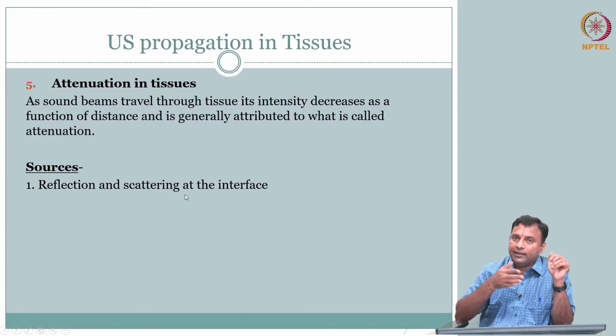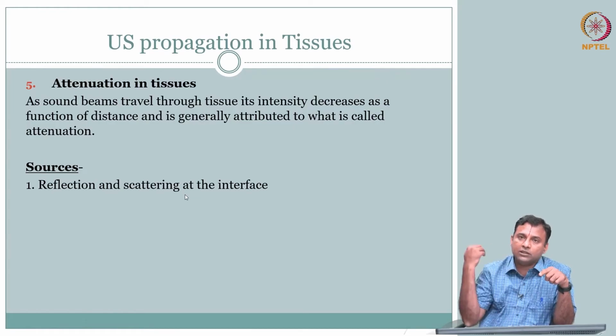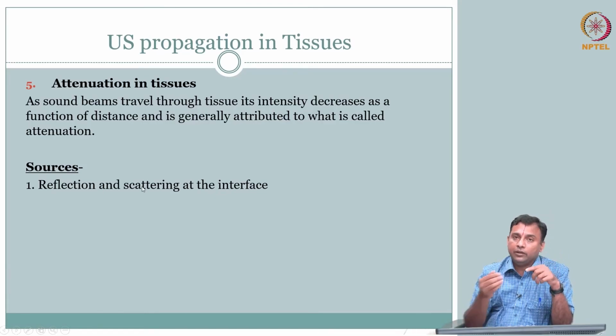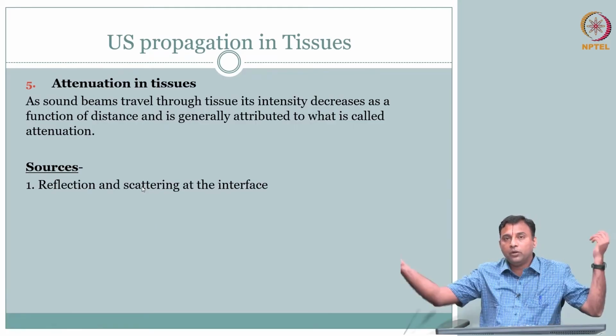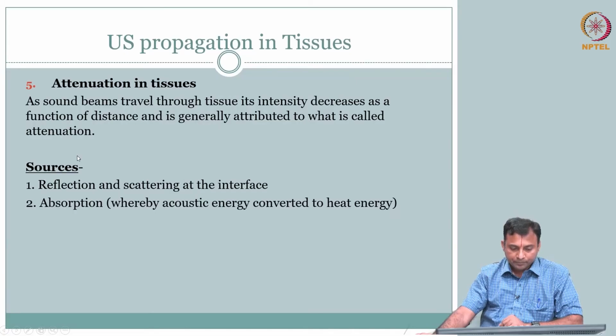I am sending the signal, some signal we just calculated, R comes back. So if you are downstream, as you go further in depth, the signal is reducing because some amount is reflected back, and because you had some interfaces, it scattered. You could not just go in one direction, you could go in several directions. We will talk about that in a minute.